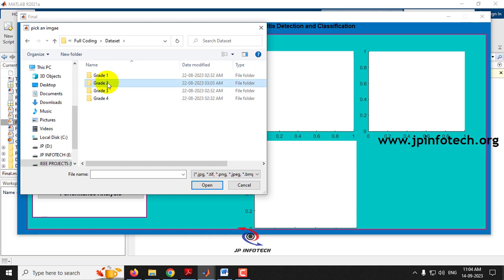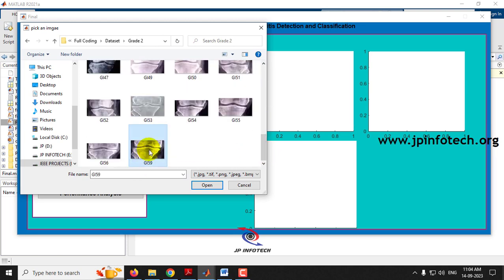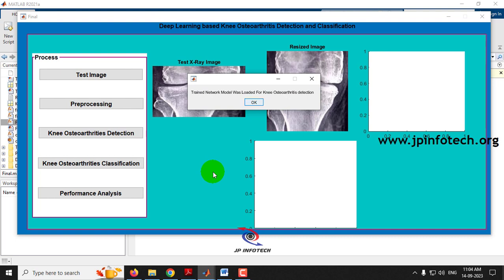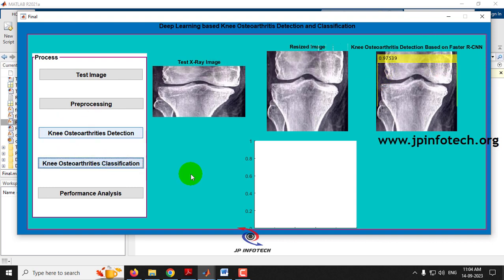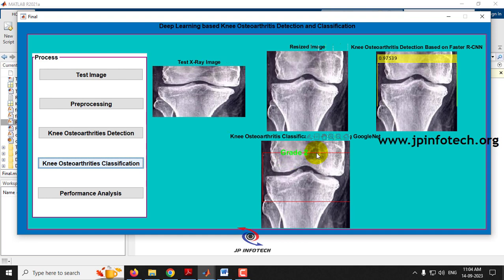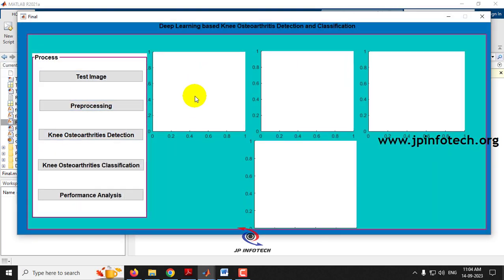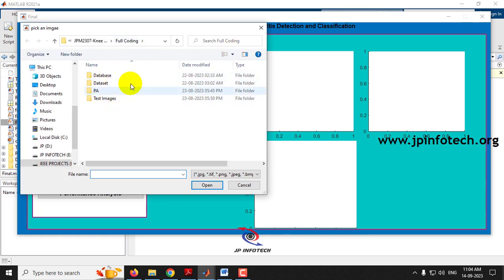Let me go back to the dataset grade 2 folder and select another image. Go for pre-processing, then the detection part, then classification. Now you can see it is correctly classified as grade 2. As mentioned, there may be a few cases classified wrongly because there is no 100% accuracy model.